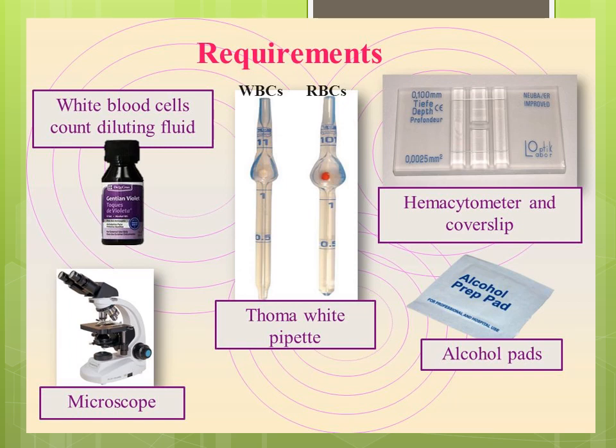Requirements: white blood cell diluting fluid, microscope, then the white pipette.